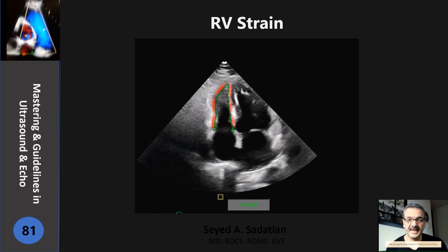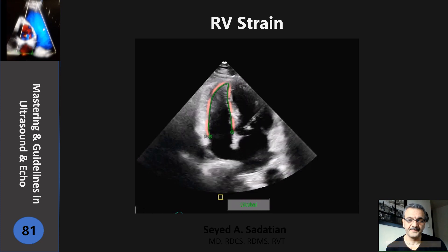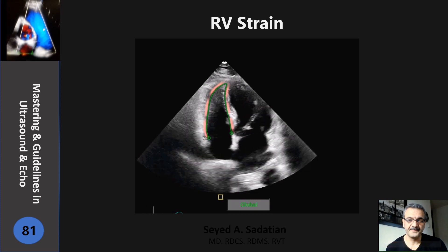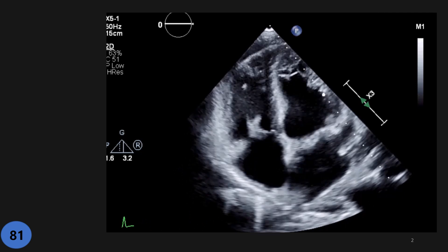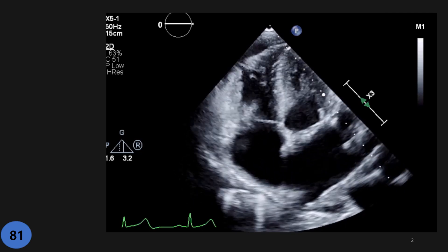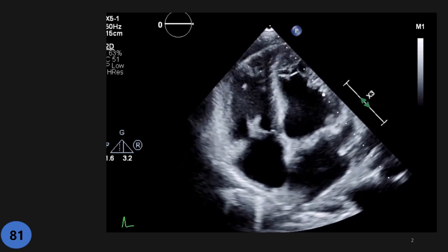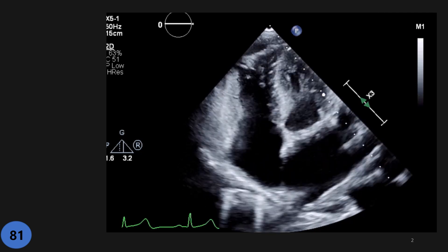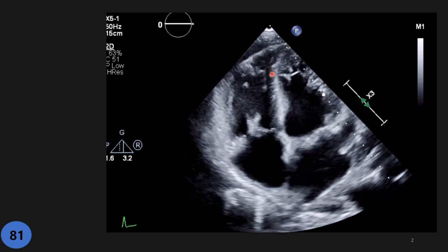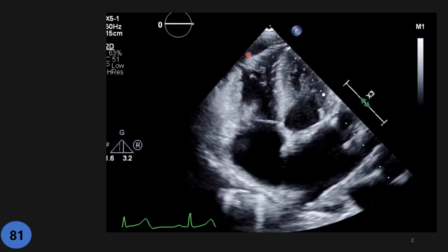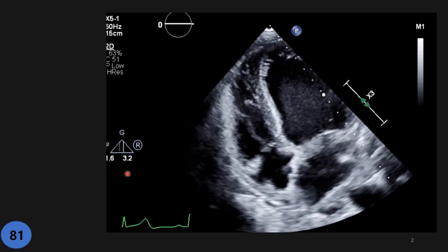Welcome to mastering guidelines in ultrasound and echo. Here we have the technique for RV strain. For that purpose, we get an RV focused apical four-chamber view that has a clear and obvious right ventricular free wall all the way.